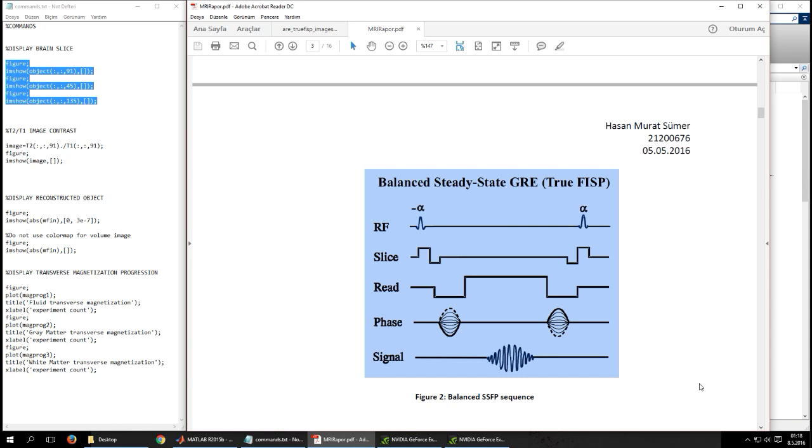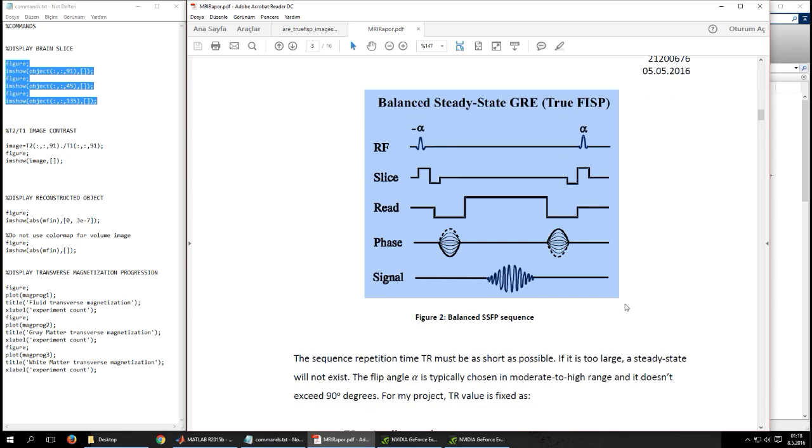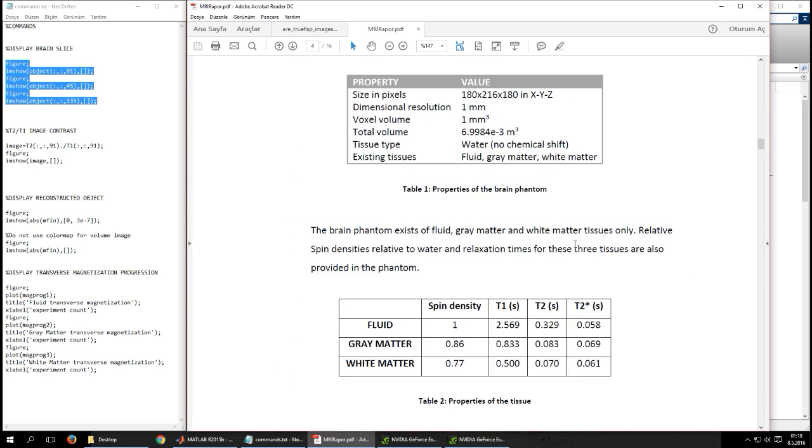If we desire to achieve steady states quickly for gray matter and white matter, we can use double inversion recovery. We apply an inverting pulse, we wait for time ti1, then we apply another inverting pulse and wait for time ti2 before applying alpha over 2 pulse. By carefully selecting ti1 and ti2, we can achieve this steady state very early in the experiment. I will demonstrate results for both single and double inversion recovery methods.